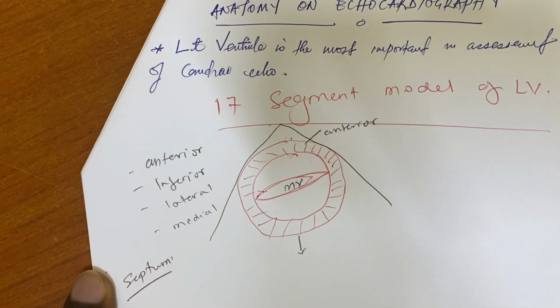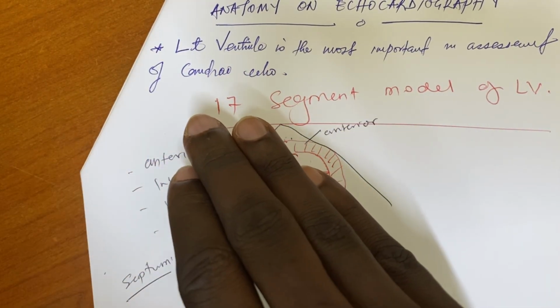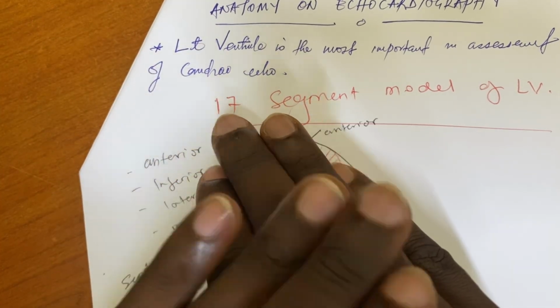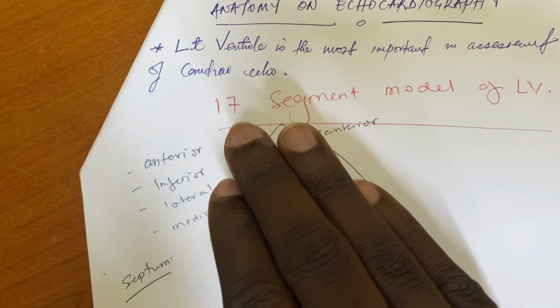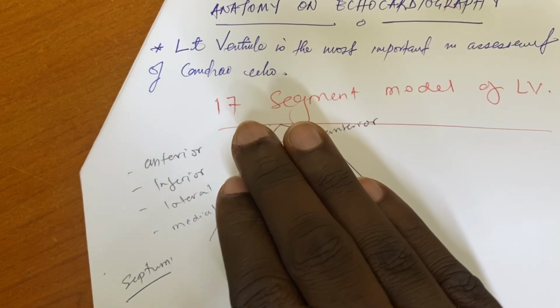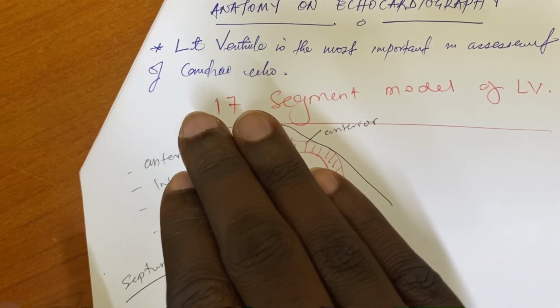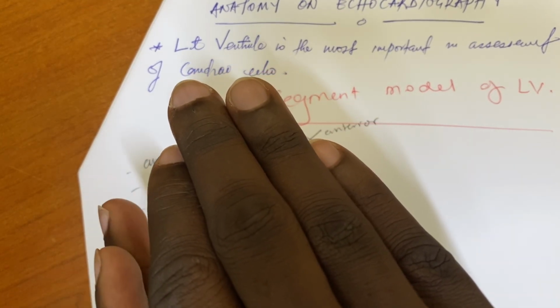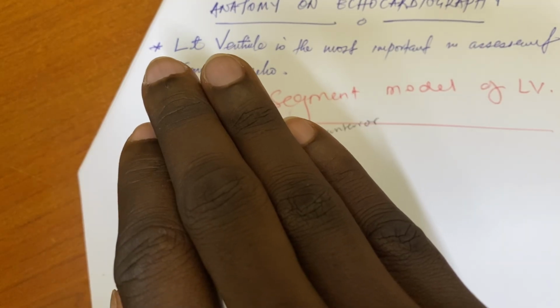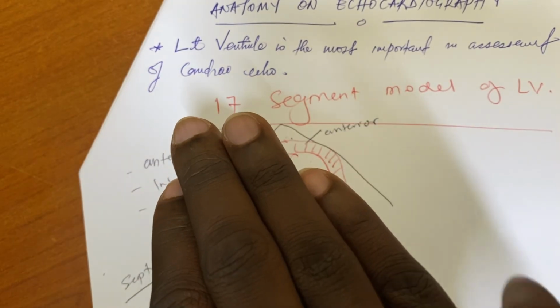Anterior, 3D. Why is it inferior? It is 3D. The heart is like this. You put the probe, this is LV. You put the probe here, you are seeing the anterior part, but what is below is inferior. You assess superior and inferior, but not like that. This is anterior, inferior. This side you have left to right ventricle. And what separates the right ventricle from left ventricle is the ventricular septum. So here we have the septum. Anterior, septum, inferior, and then the other side, lateral.